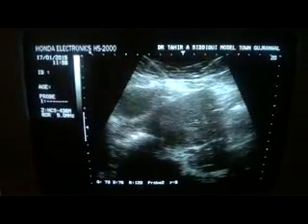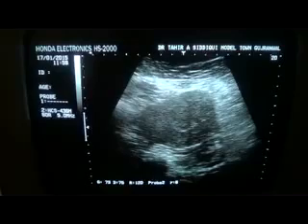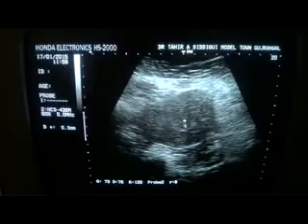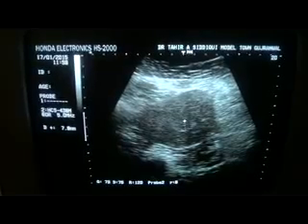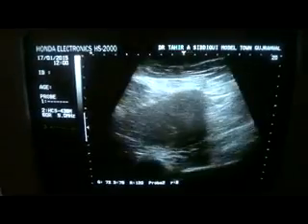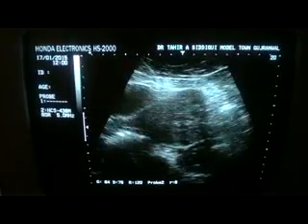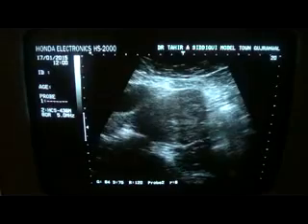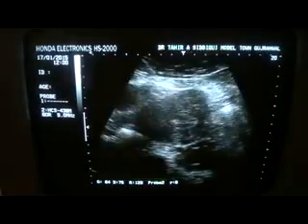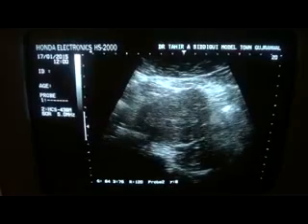This is the transverse section. This is a small tiny cystic area. This one measures approximately 7.9 mm. There is a trophoblastic reaction seen around it, and this small tiny cystic area is consistent with a gestational sac. Incomplete abortion.